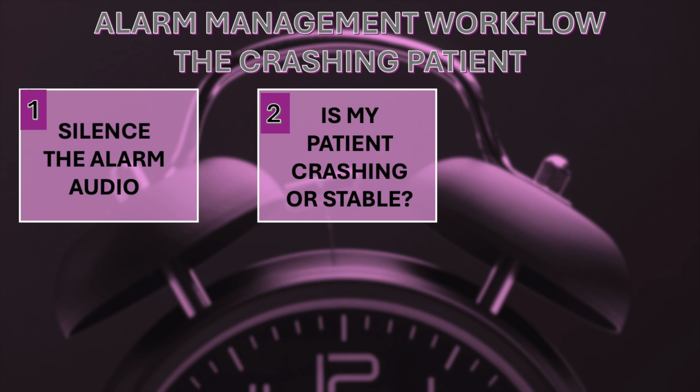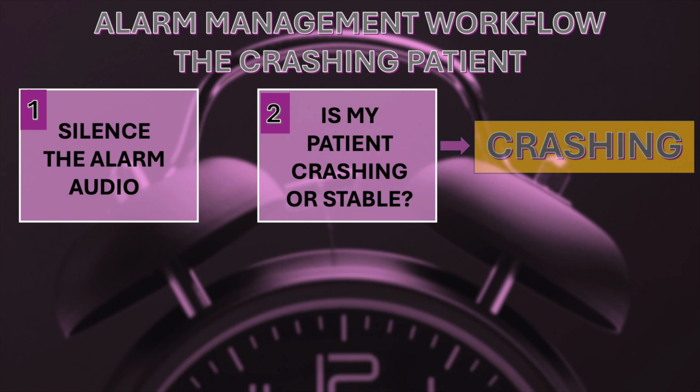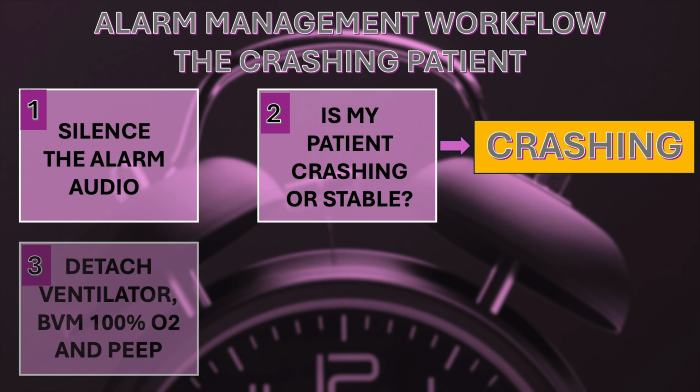Along with the barrage of alarms, you notice that the pulse oximetry and end tidal CO2 levels are falling and chest rise is minimal. The patient is indeed crashing. Step 3, if you have a patient crashing on a ventilator, disconnect the ventilator immediately and provide bag mask ventilation using 100% oxygen with PEEP. That's correct. Step 3 of the alarm management workflow emphasizes the need to disconnect the ventilator promptly and perform bagging with 100% oxygen and appropriate PEEP.